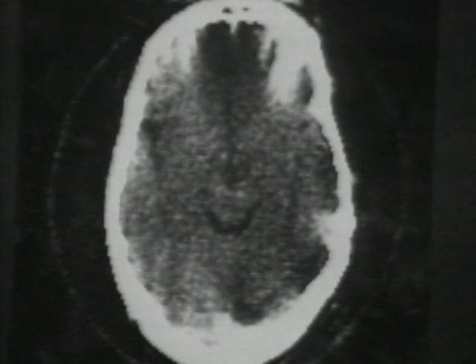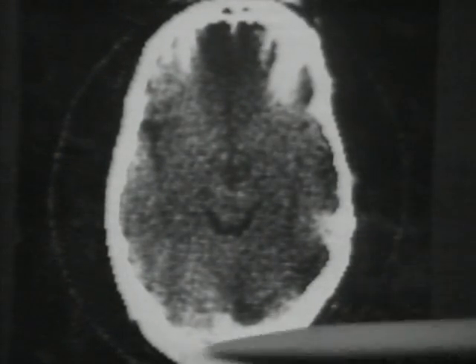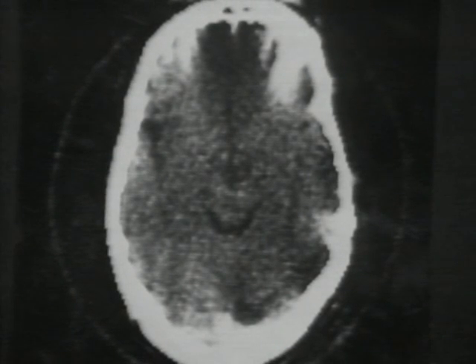Here is another patient with a lesion which was difficult to identify in the normal scan. This was a patient who had a sudden vascular incident which left him with cortical blindness. Now the chances were that this patient had somehow or other occluded his posterior cerebral artery circulation.